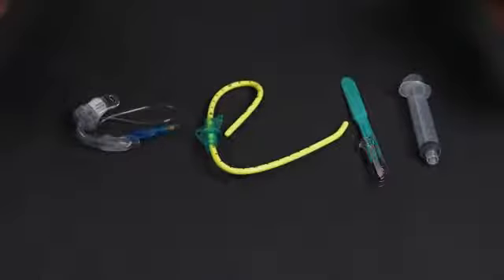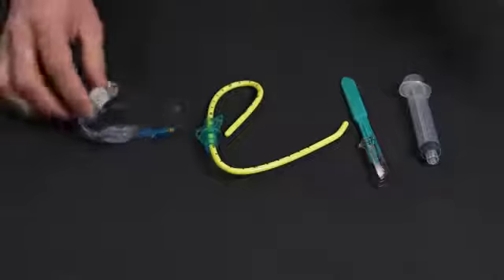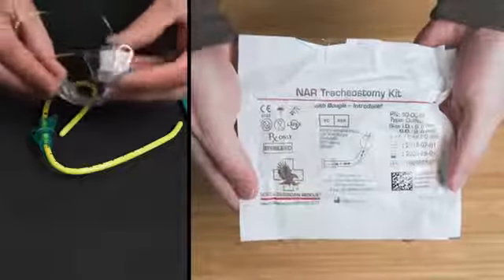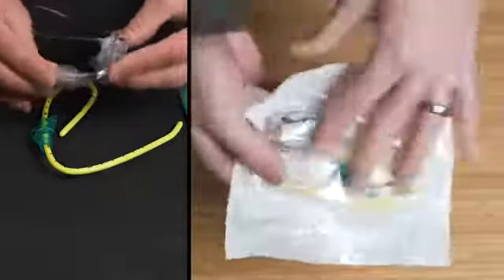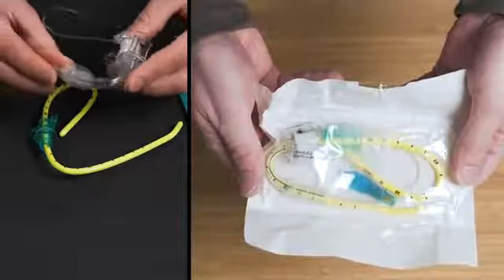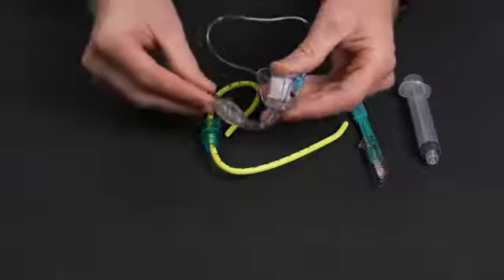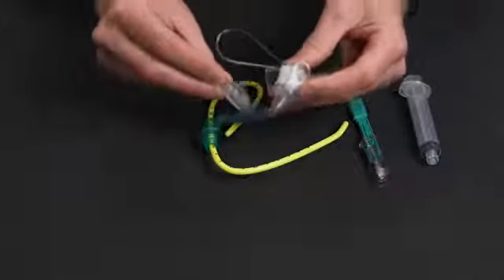So to perform this procedure, we need four main things. The first thing we need is the tube. Now, this guy here is a specialized cric tube. This is made by North American Rescue. And I like using things that are actually made for this procedure because this prevents putting it in too deep. It prevents cutting the tube down and causing any issues. It's just a lot simpler.